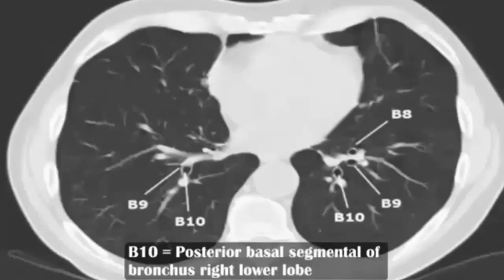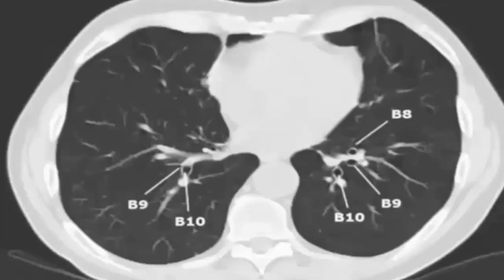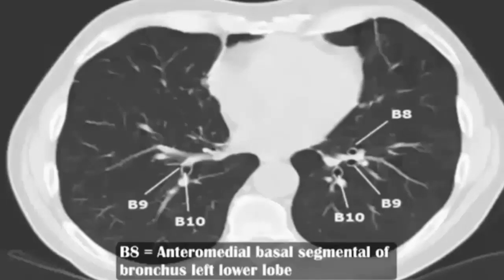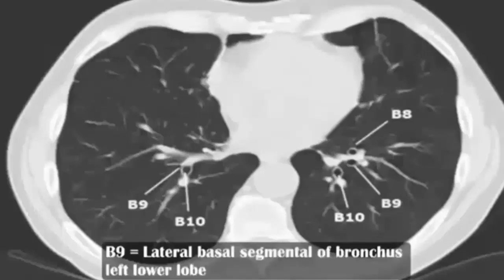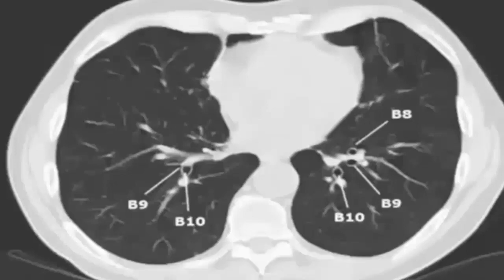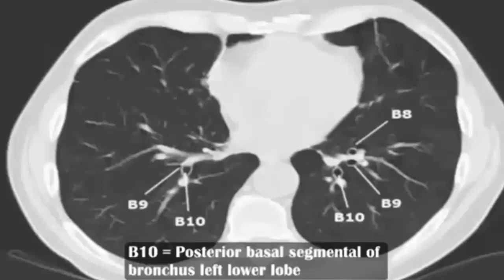B10: posterior basal segment of bronchus, right lower lobe. B8: anteromedial basal segment of bronchus, left lower lobe. B9: lateral basal segment of bronchus, left lower lobe. B10: posterior basal segment of bronchus, left lower lobe.